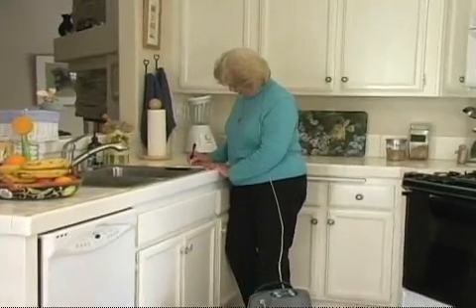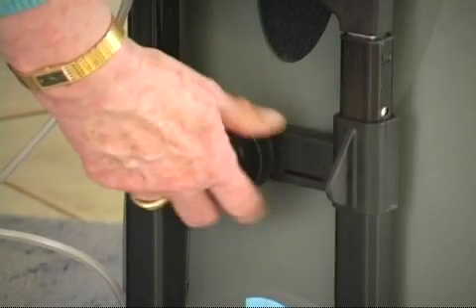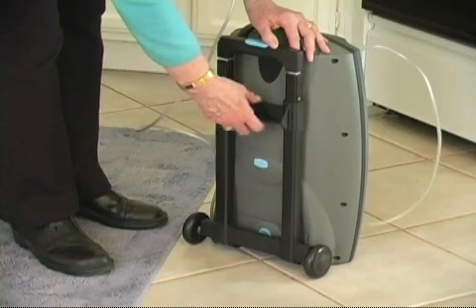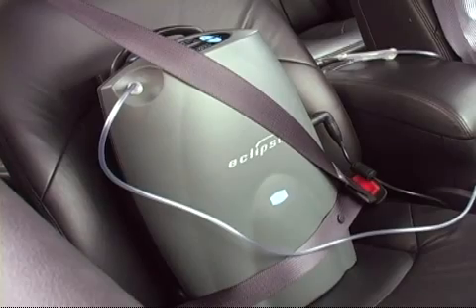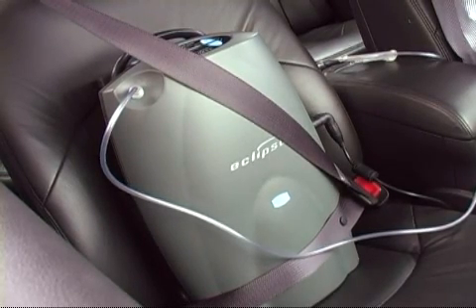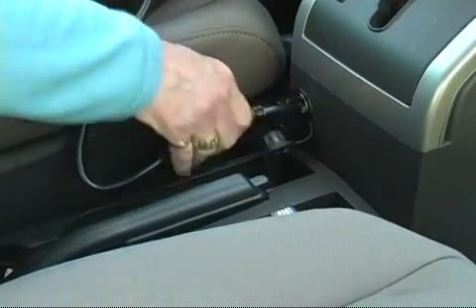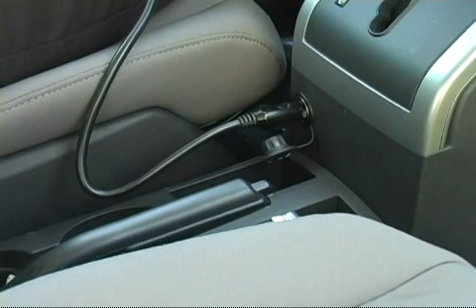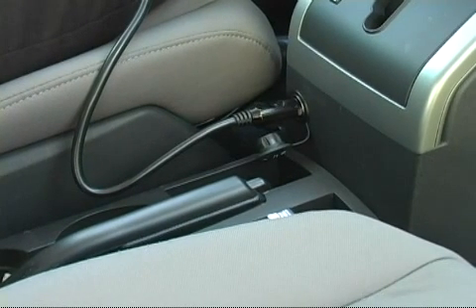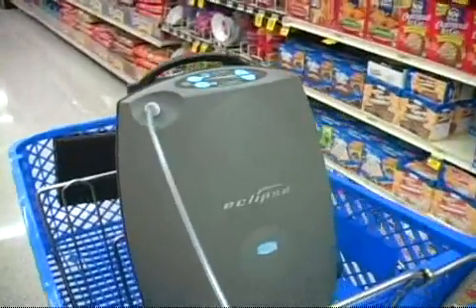Let's say you're heading out to do some shopping. Before leaving home, affix your Eclipse II to its mobile cart and make sure the power cartridge is fully charged. Once in your vehicle, secure the Eclipse II with a seat belt to prevent damage to the unit during sudden stops. Always start your vehicle first, then plug the Eclipse II into the vehicle's auxiliary DC power outlet. We recommend keeping the Eclipse II plugged into the vehicle's power outlet while driving to your destination. That way, you'll preserve the power cartridge charge for your actual shopping time.